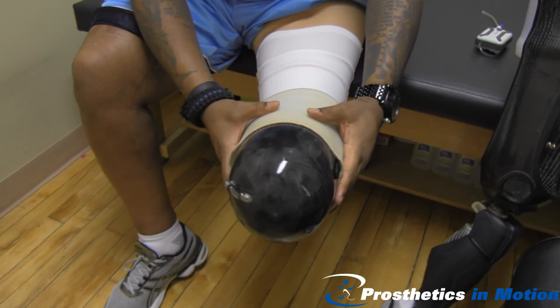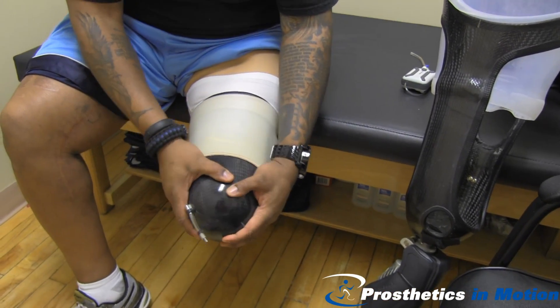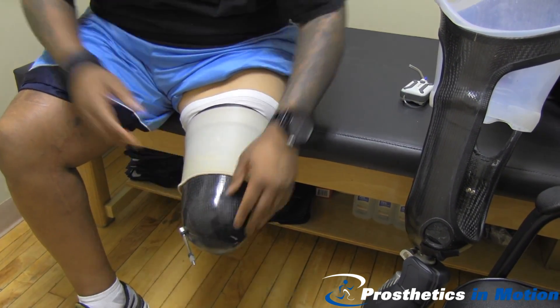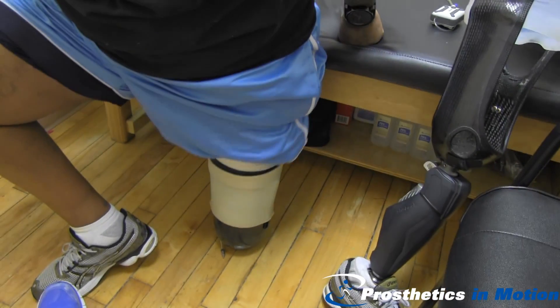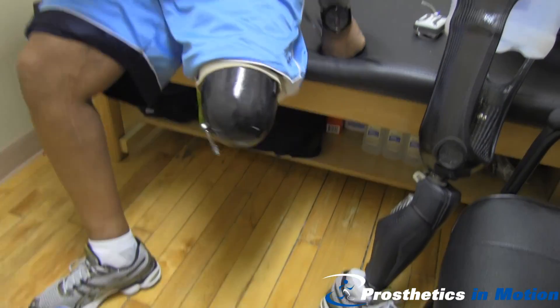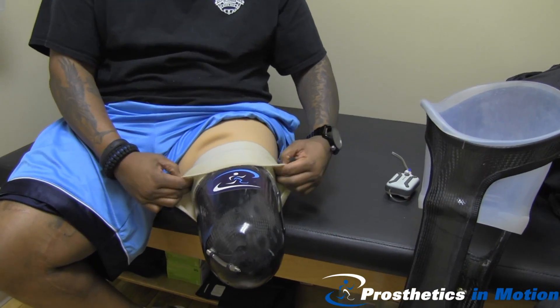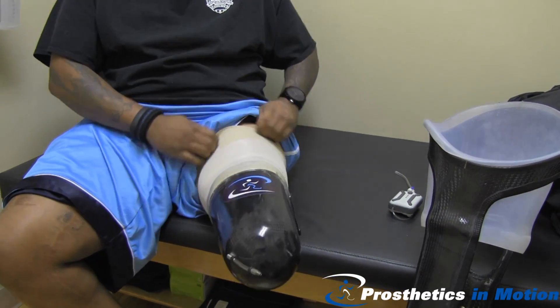Since he is a knee disarticulation, he is able to take weight on the distal end of his residual limb. However, he can't take 100% weight. On top of the socket is a knee sleeve. Air is coming out of the valve at the distal end, and then he rolls his sleeve on, which will seal onto his liner.